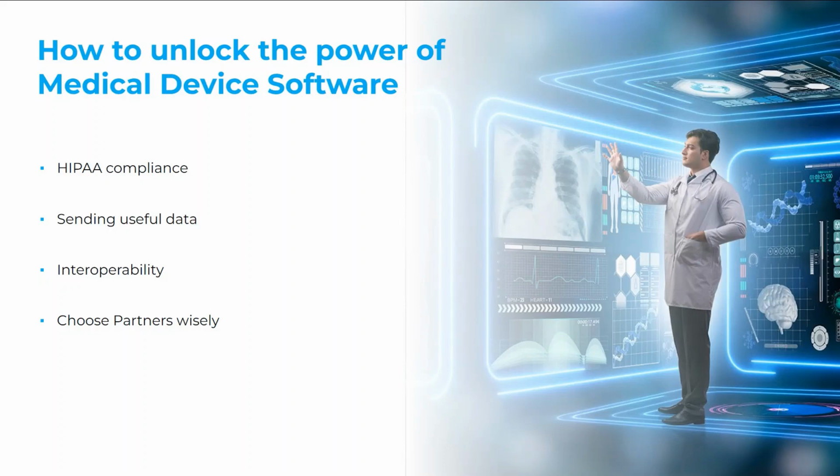But the software behind it, how it needs to work into the physician's workflow, how it needs to send data, what data it needs to send. So, of course, HIPAA compliance is the first thing we'll look at. Everyone's always concerned about HIPAA. There isn't direct guidance on medical devices for HIPAA, but basically, depending on the population that you're serving, you need to follow the rules for HIPAA for that population.